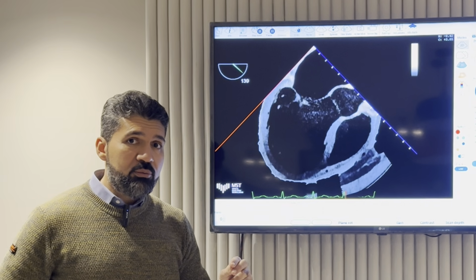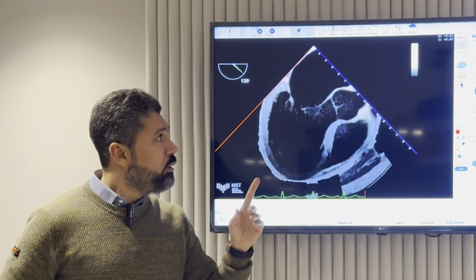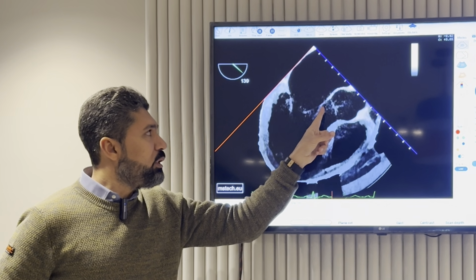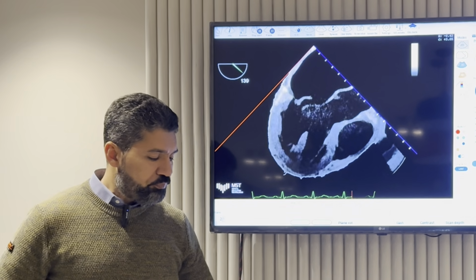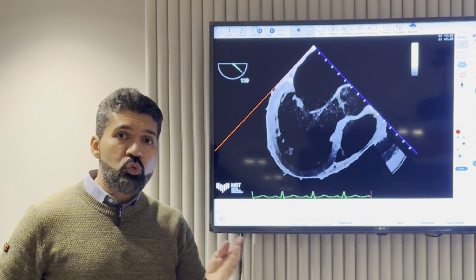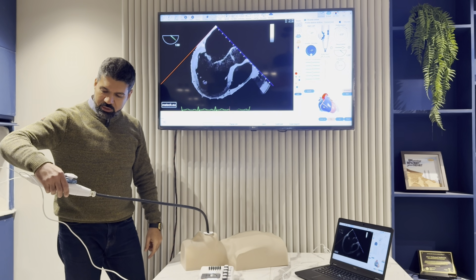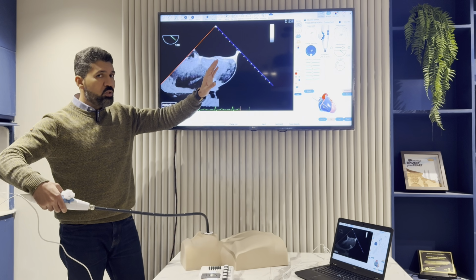The 4-chamber view without aortic valve open, it's an A2 and P2 but oblique cut. And the long axis view, this is the clear and sharp A2 and P2 cut in the middle of A2 and the middle of P2. Here is P2 flail. If you are in the long axis view like this, it's a good chance to sweep throughout the mitral valve. So if I went to the right side of the patient just by turning the probe to the right like this, the whole probe, then I can see the interatrial septum.